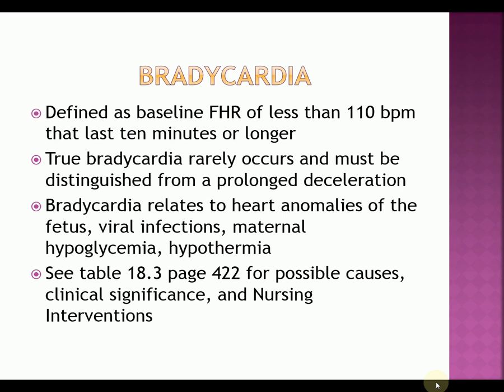So bradycardia is when it's less than 110 beats per minute that lasts 10 minutes or longer. True bradycardia rarely occurs, and it has to be distinguished from a prolonged deceleration. Bradycardia relates to heart anomalies of the fetus, maybe viral infection, maternal hypothermia or hypoglycemia, but it very seldom occurs. When it does occur, it's not a good sign either.